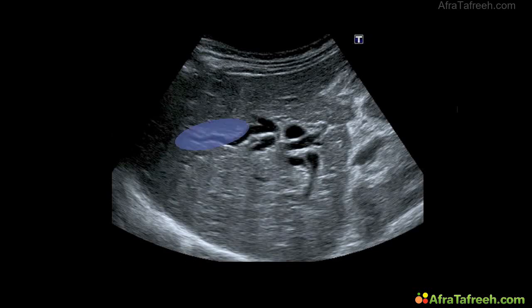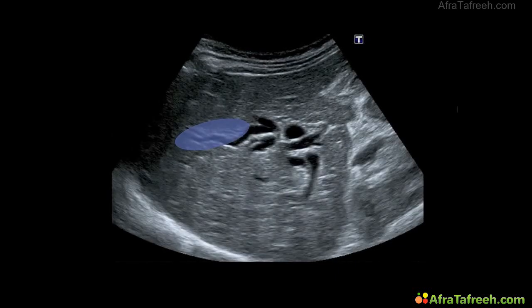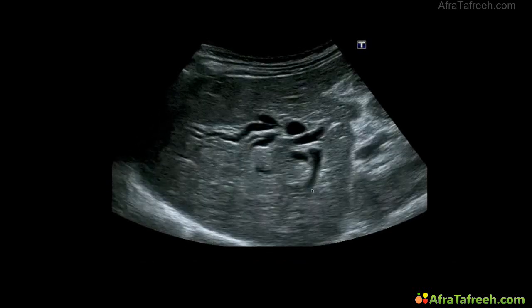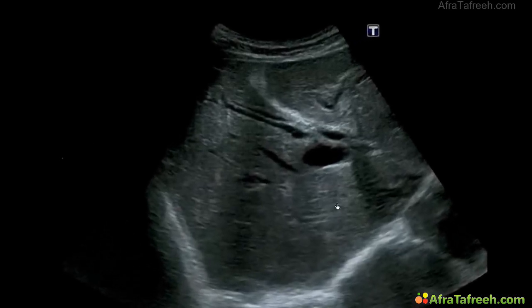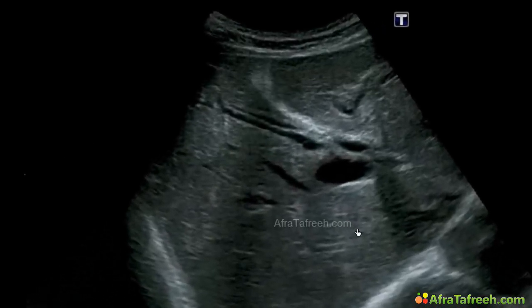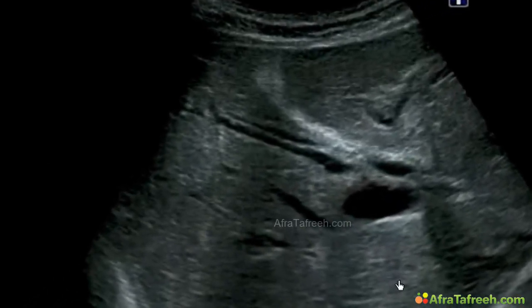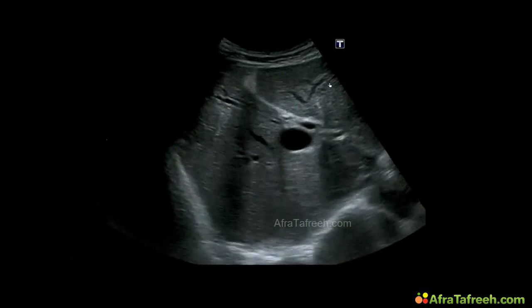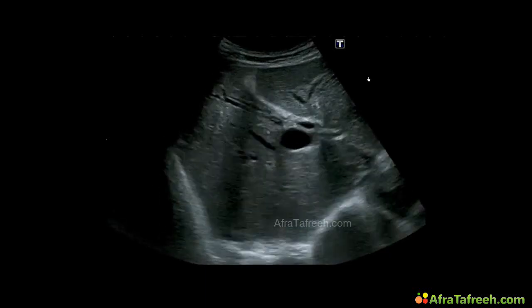I will show you the clip once again. In this area and over here, there are bile ducts, intrahepatic. And there you see the double channel sign, or the so-called double barrel shotgun sign. These two tubular structures over here and here are an indication for dilated bile ducts intrahepatic.